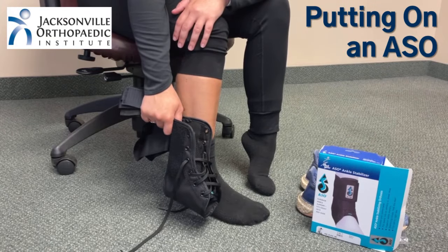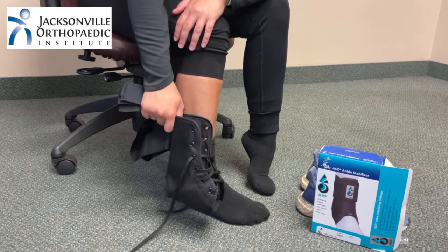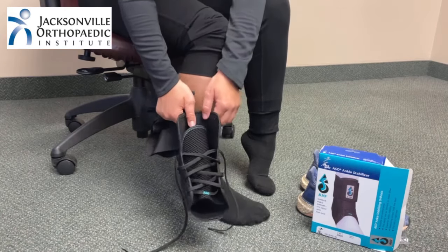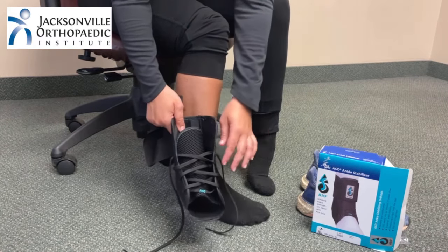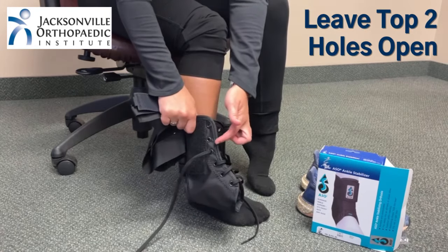We're going to show you how to put on an ASO ankle stabilizer brace. Remove the brace from the box and then string the laces like a shoe, but leave the top two holes empty on both sides.